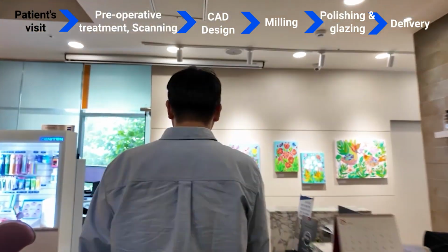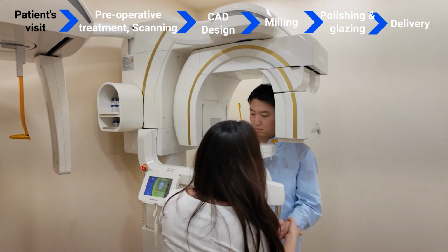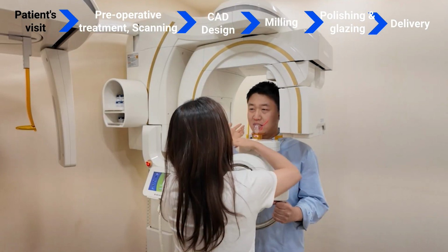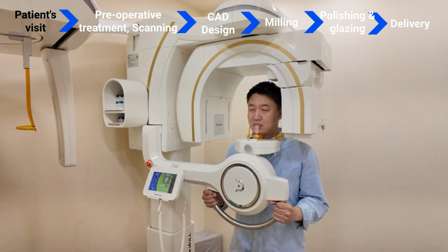Today, I'm thrilled to show you a step-by-step guide of getting a ceramic inlay, all in just one visit. We're using the cutting-edge Medit scanner, i900, so let's get started.